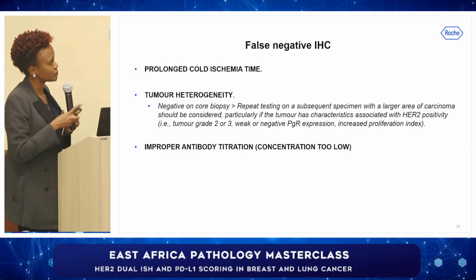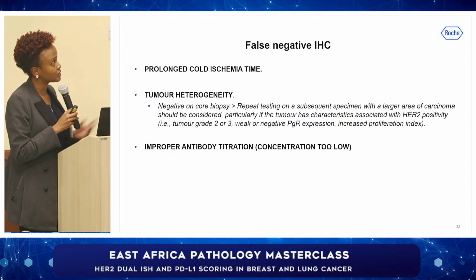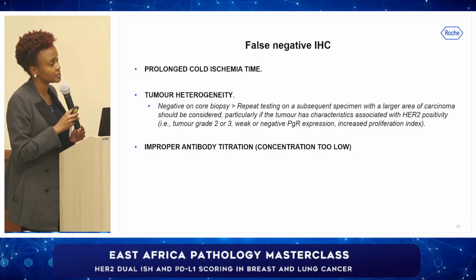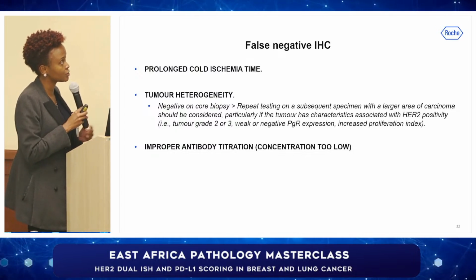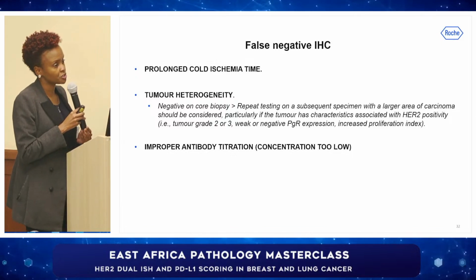False negative results are not very common, but they can occur. They'll typically be due to prolonged cold ischemia time. We know that we should limit this to 1 hour. Maybe due to tumor heterogeneity.